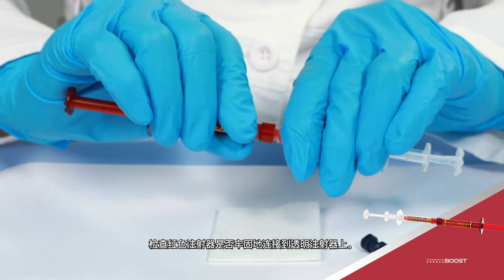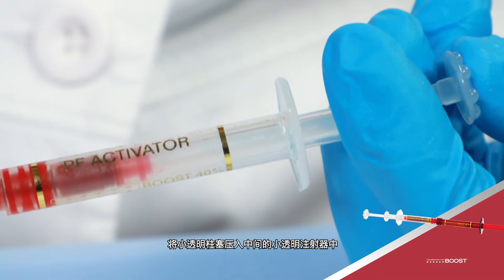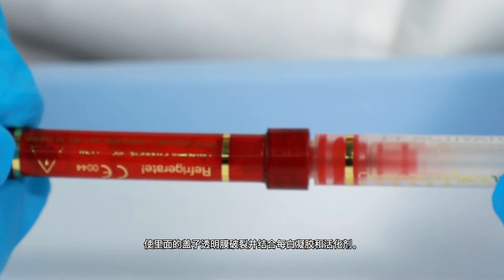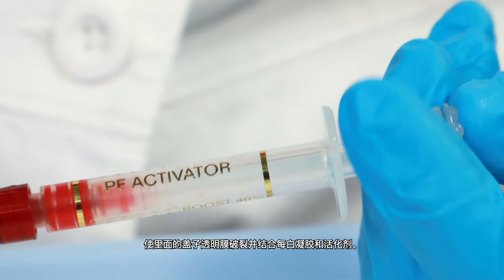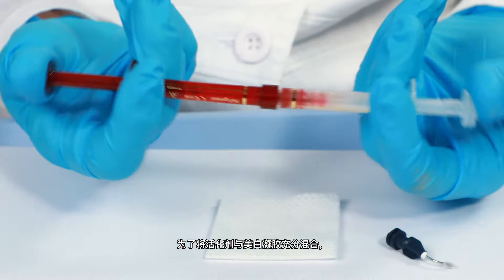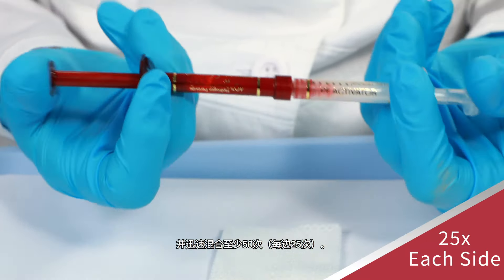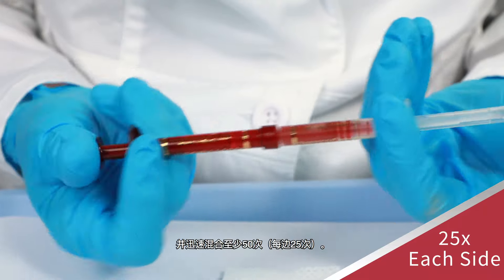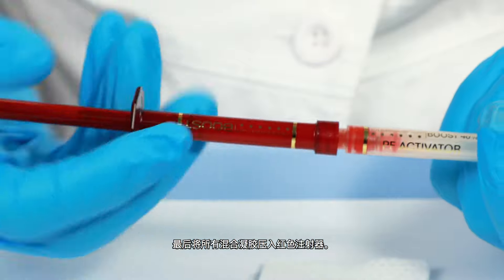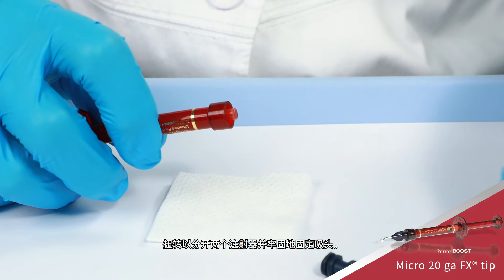Before mixing Opalescence Boost whitening, check that the red syringe is securely attached to the clear syringe. Depress the small clear plunger into the middle small clear syringe to rupture the internal membrane and combine the whitening gel and activator. Press the red plunger completely back into the clear syringe. To thoroughly mix the activator with the whitening gel, push stems back and forth continually with thumbs and mix a minimum of 50 times rapidly — 25 times each side. Press all mixed gel into the red syringe, twist to separate the two syringes, and securely attach tip.